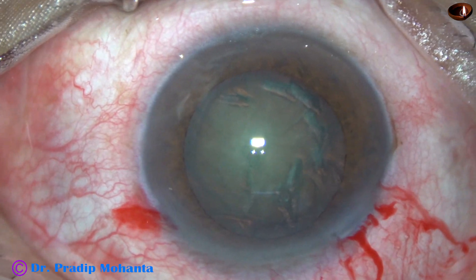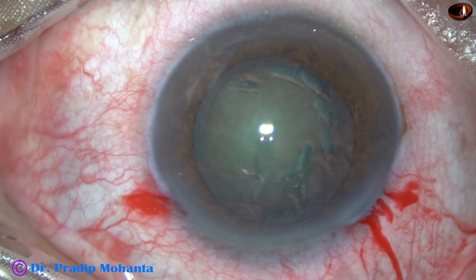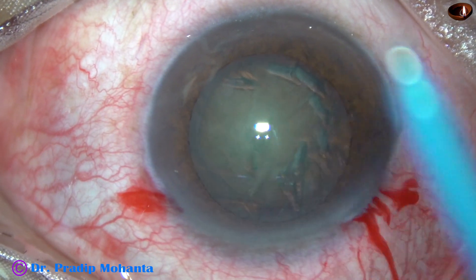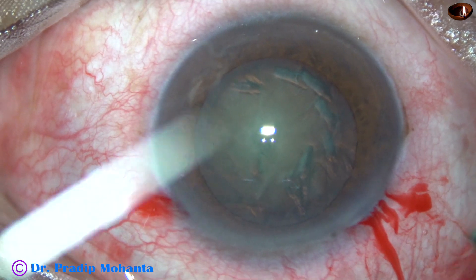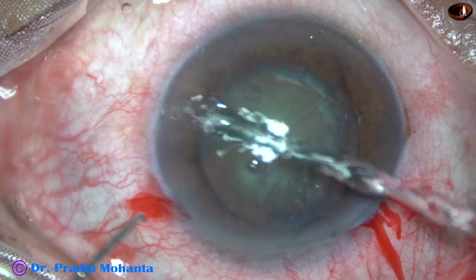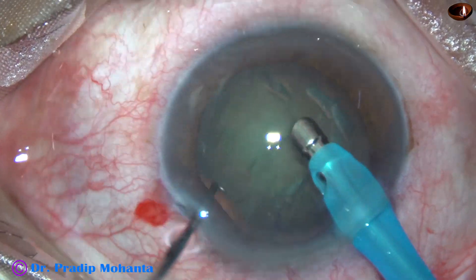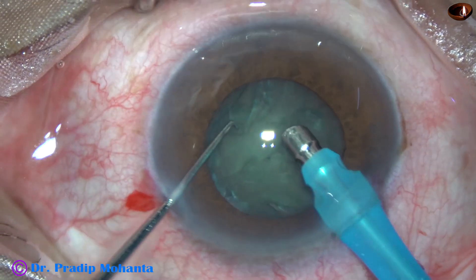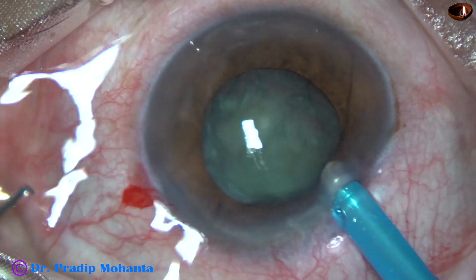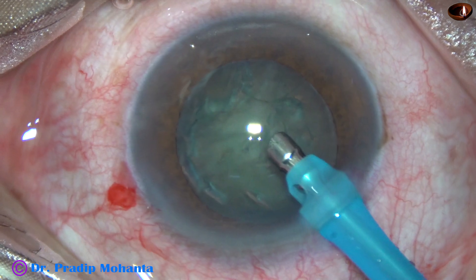With VISCO, the pupil has increased a bit. As we go in with irrigation, the pupil will enlarge — just watch. As we go in, the pupil increases in size. But as we rotate the nucleus, it decreases in size. So as we go in with irrigation, it increases in size.